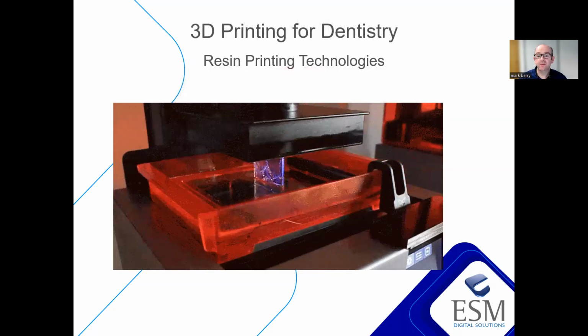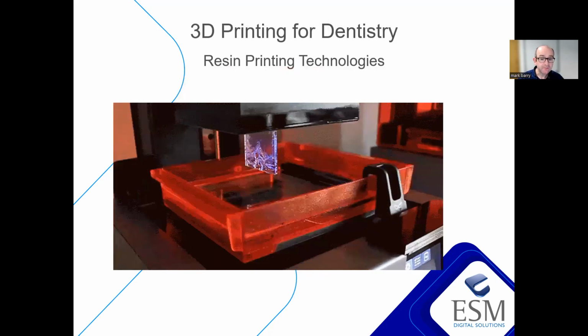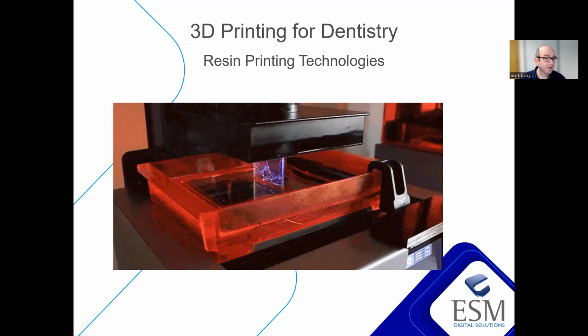Resin-based printing is where things are at for dental applications. We have a much wider range of materials. That's where the focus is for all the technologies. It gives us much higher resolution, a much higher level of detail.